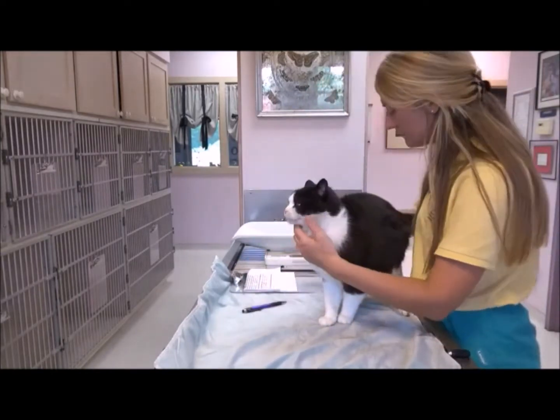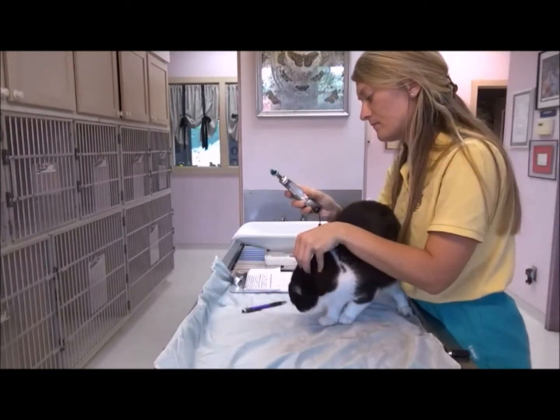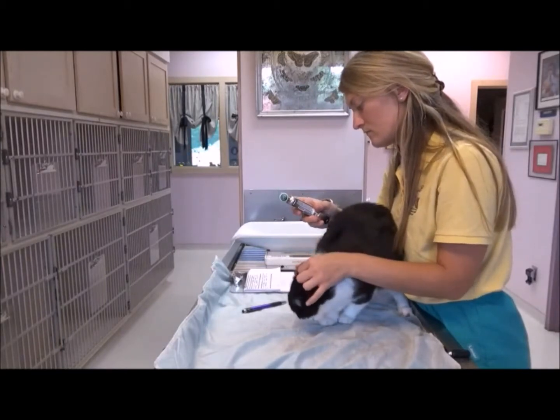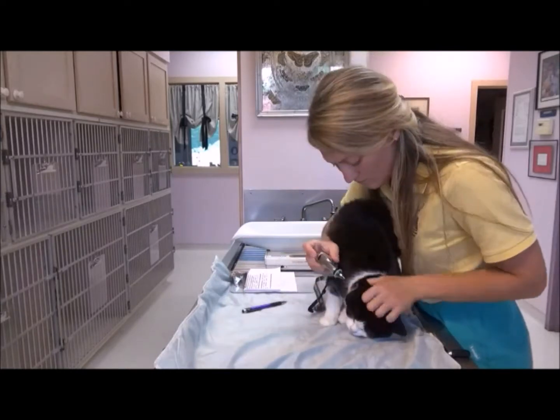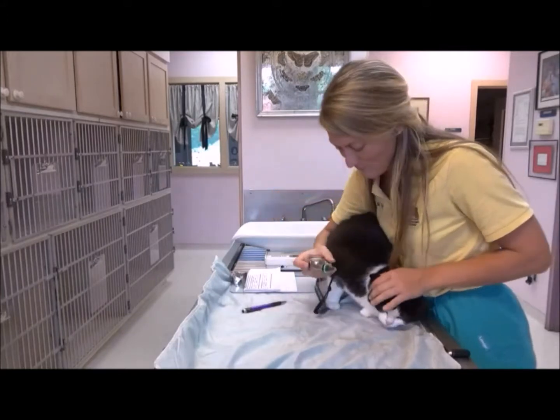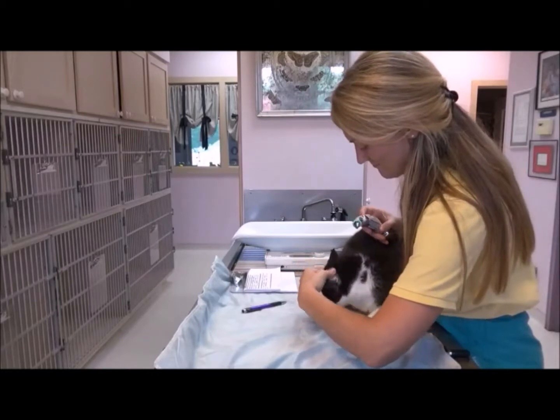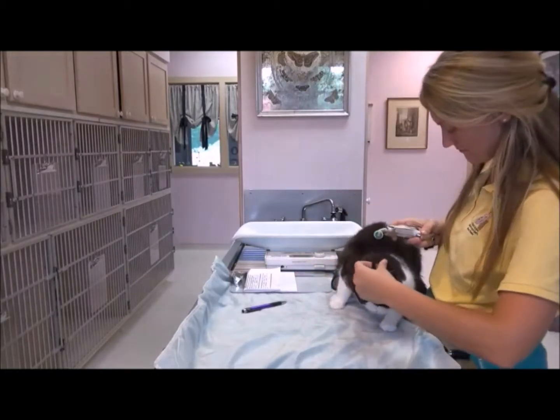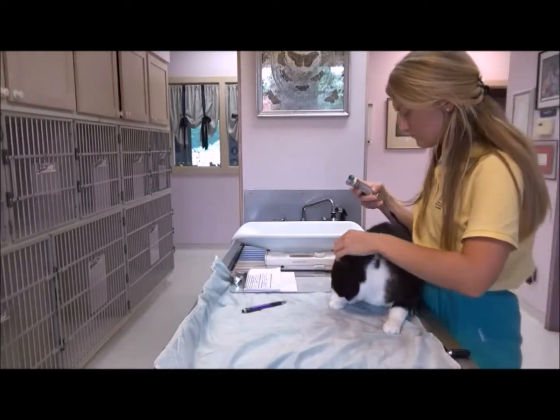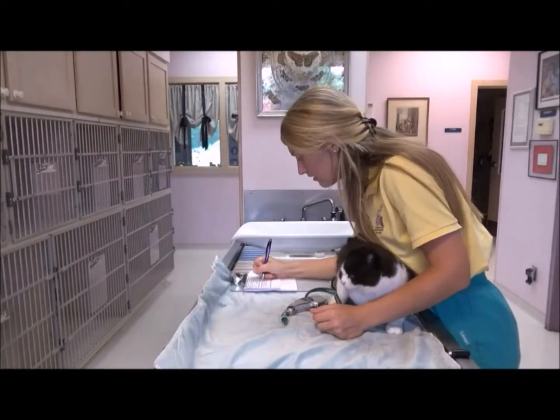Okay, so that's 32. Now I'll check his temperature using an ear thermometer. It's okay, Chancy. Good boy. Oh no, it's too low. We'll try again. Let's try here, there we go. Okay, so that's good. It's 100.1, so that's a good number for a cat.